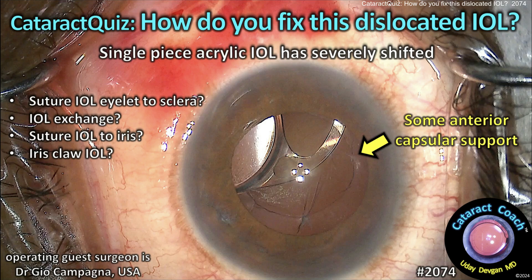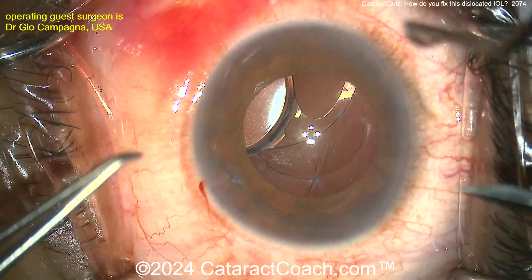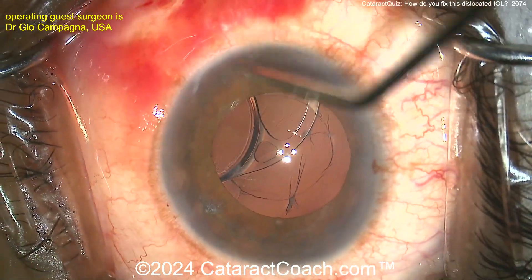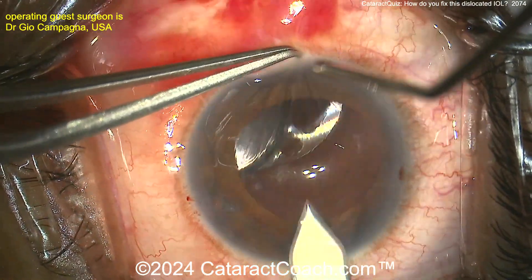cataractcoach.com — a cataract quiz: how do you fix this dislocated IOL? The single-piece acrylic lens has severely shifted. Look carefully — that lens actually has a little eyelet on it, looks like maybe a B&L Akreos or Vista lens. There's an eyelet at the haptic-optic junction, so could you just pass a suture through that — a Gore-Tex or something — and bring it over?